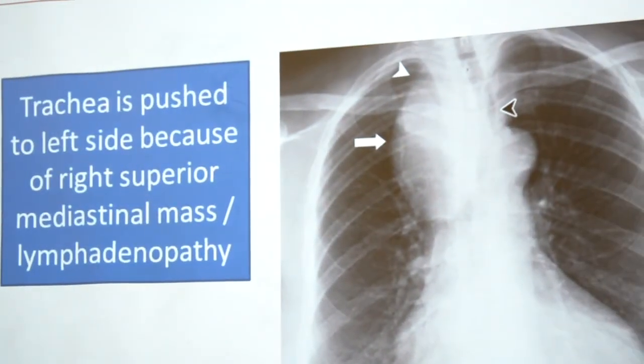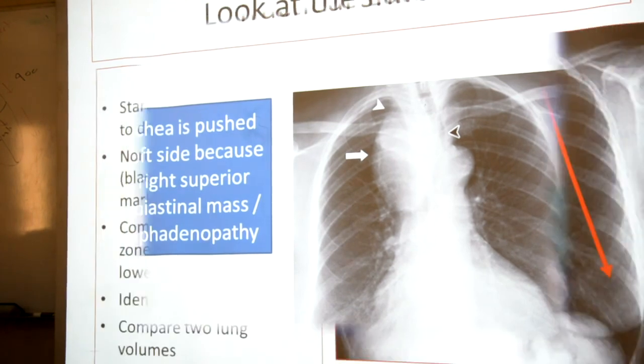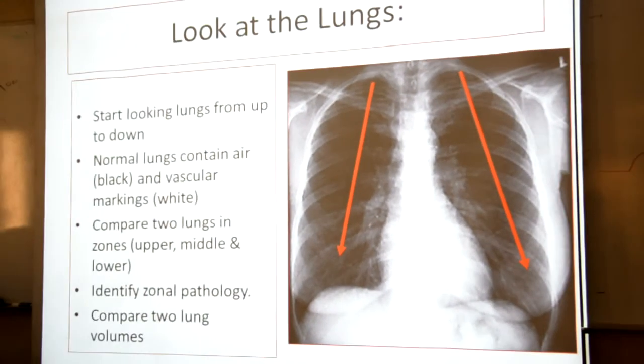So now you understand the tracheal importance, the tracheal lucency, how important it is. Now the next item is to check the lung.